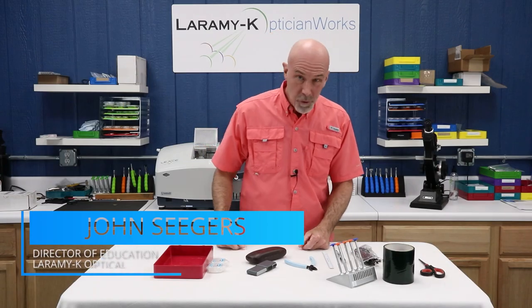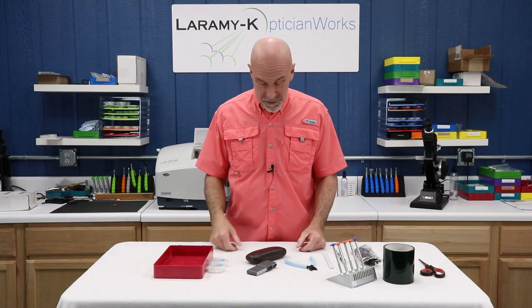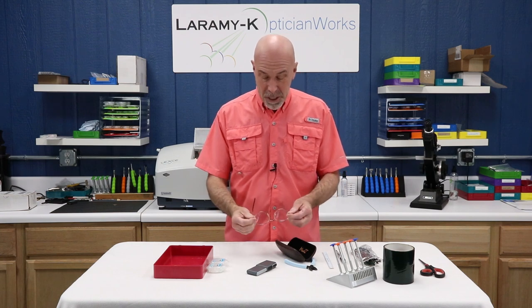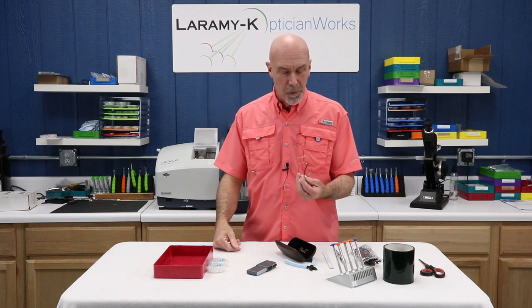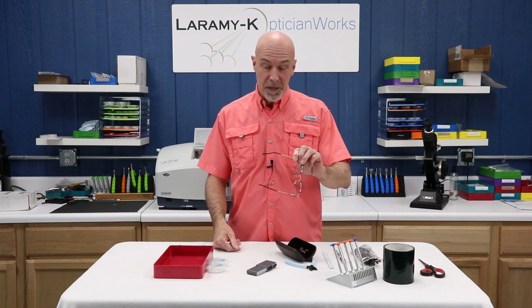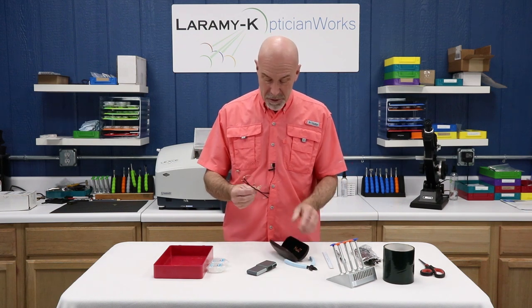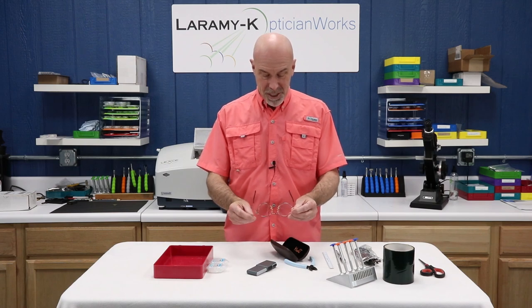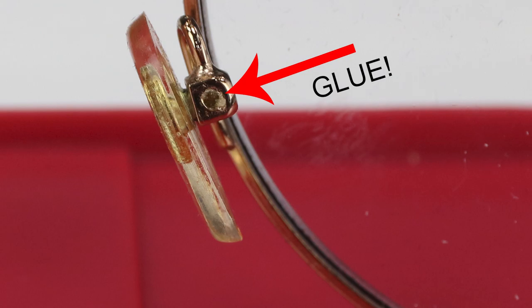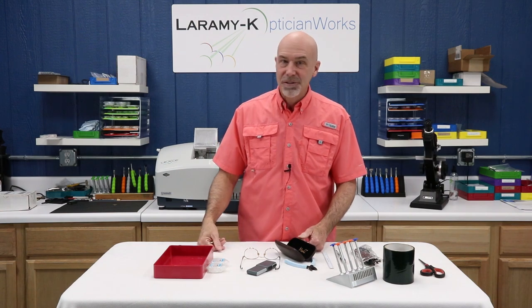Hello! I would like to welcome you to the Laramy-K Optician Works Training Center, where the other day a friend said, 'I've got this pair of glasses that I love, but they're just a little bit too short in the temple. Can you help me?' I took them out, took a look, and said yeah, I can do that, and I'm going to show you how. Thing is, I got them home, opened up the case, and realized they need some alignment. The nose pads are yellow. It looks like one of them is glued in place. The eye wire is loose. We've got some work to do. Let's get to it.